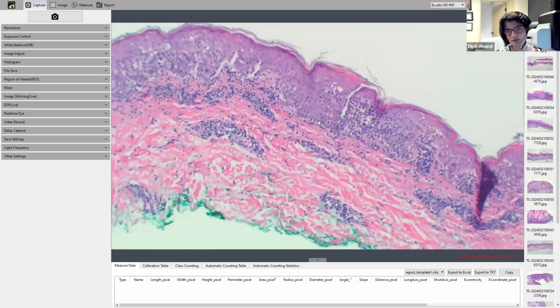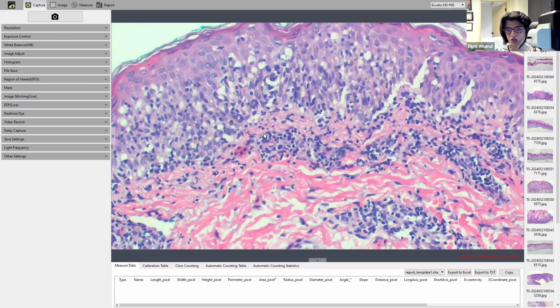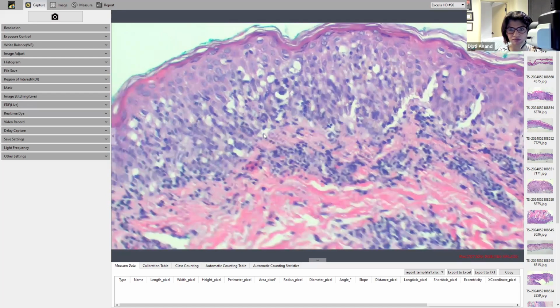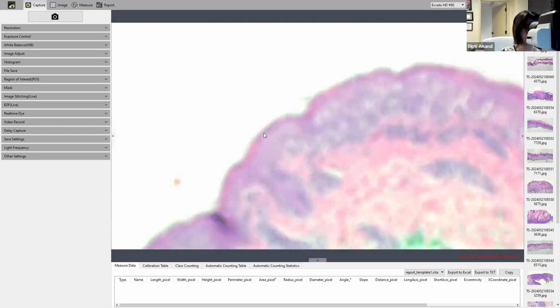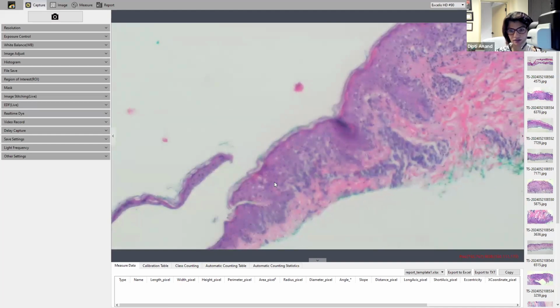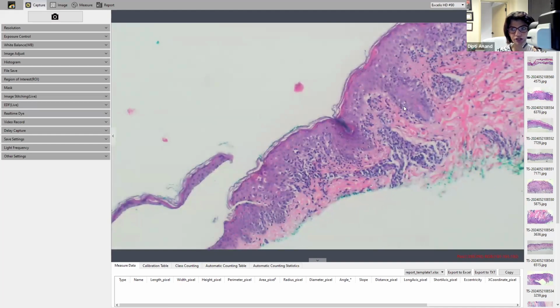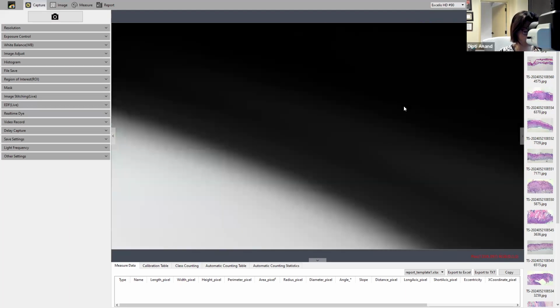So this is also an interface. You can see vacuolar, but again, it's acute, the stratum corneum. And you see that the lymphocytes in the epidermis are very prominent, more than the necrotics. You could come up with an acute interface. You do see necrotics here, and it's obviously vacuolar alteration, but the lymphocytes, sorry guys, let me just take this out of the stage.